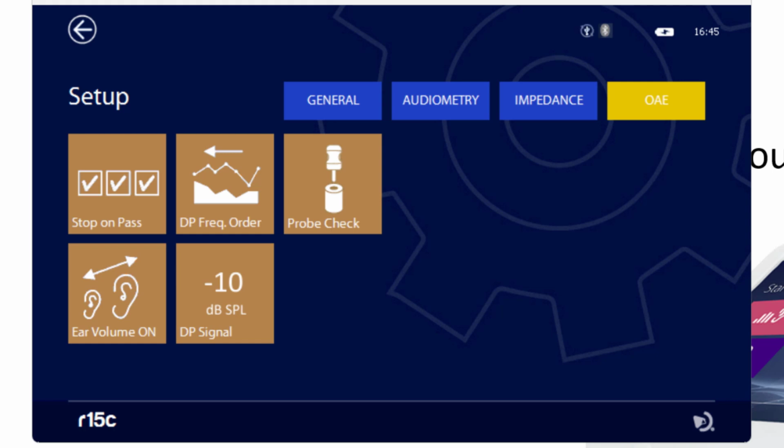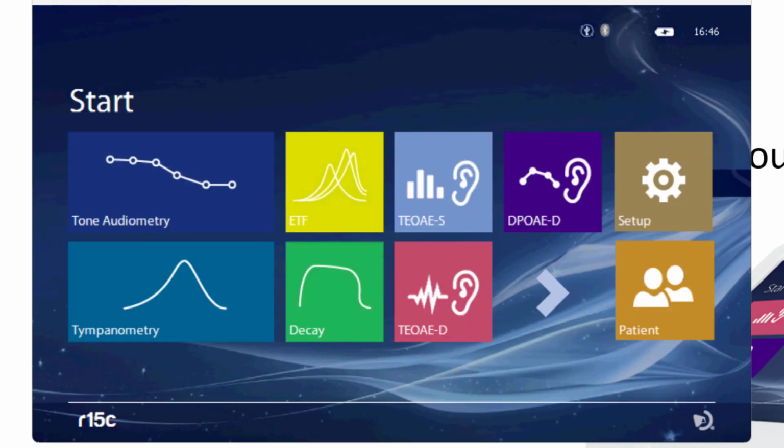It means that if people use it a lot, but they don't clean the probe tip properly or often enough, you actually get dirt being collected because this cavity will scrape it off each time. So if you see a dirty cavity, it's a signal that your customer is not cleaning the probe tip properly enough, and you could give them a gentle hint that they need to pay attention to that.